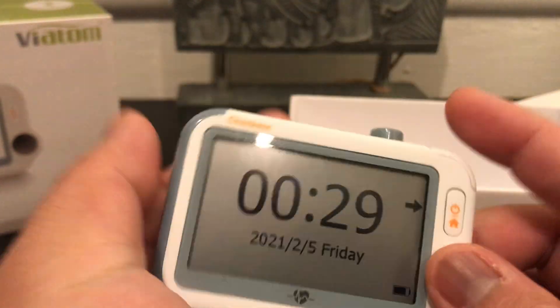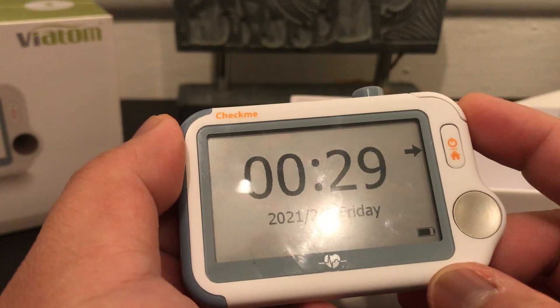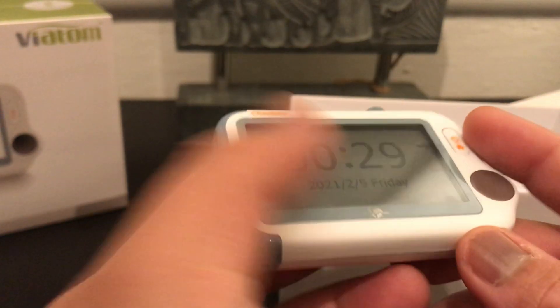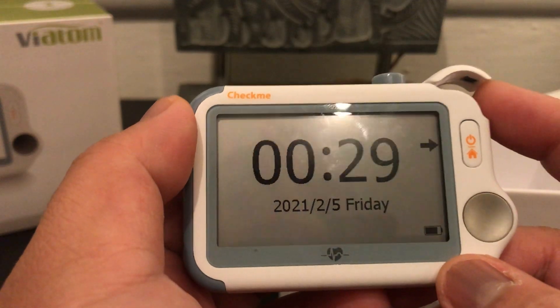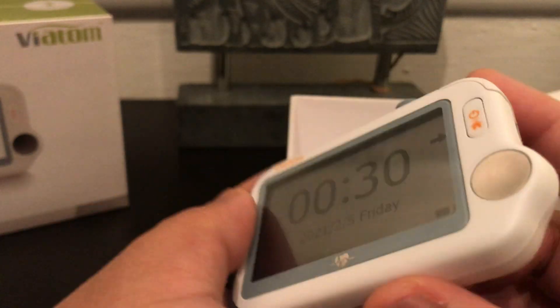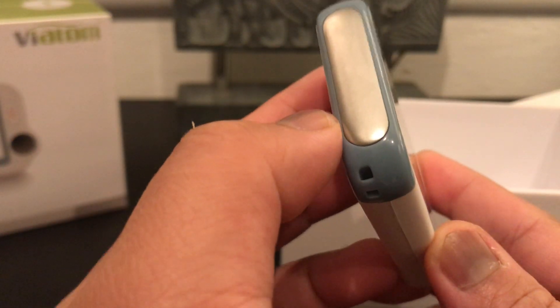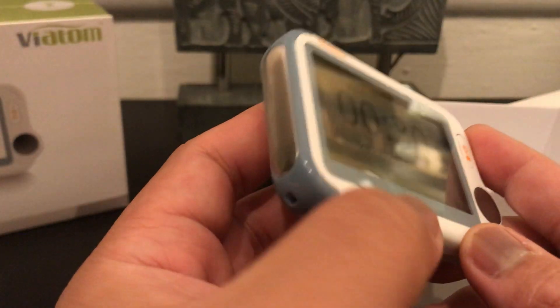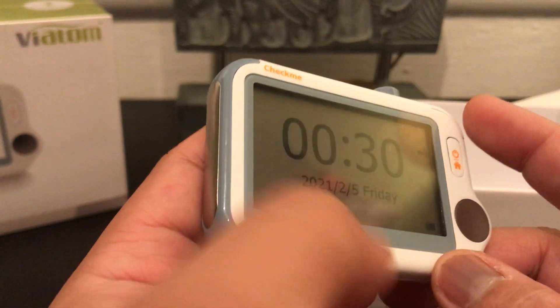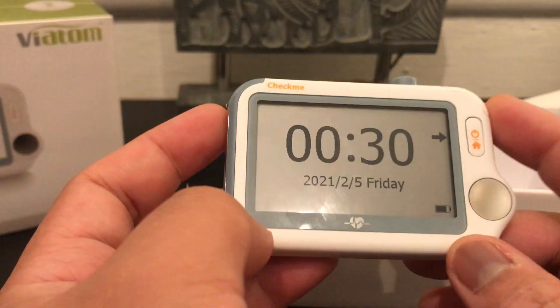This is also great for professional healthcare individuals working in the field or in a clinic. It replaces those bulky EKG devices, and it also checks oxygen level, temperature, and sleep apnea — so all those features are great for this little tiny device. If you're a doctor in the field, you can check a patient's vitals and EKG without bringing them back to the office or carrying bulky devices into the field.